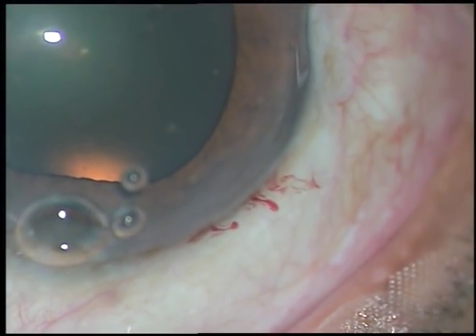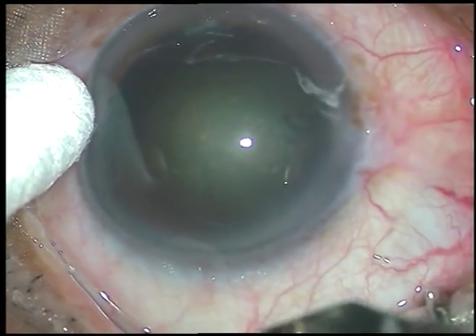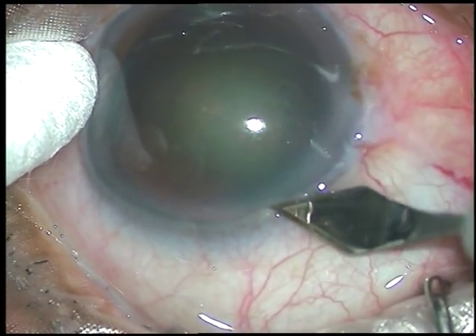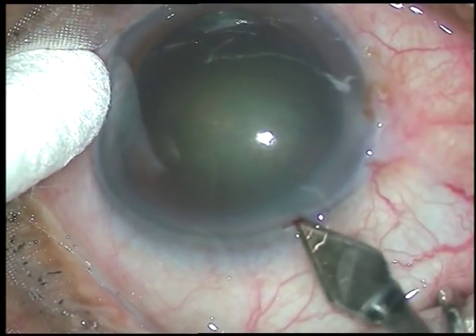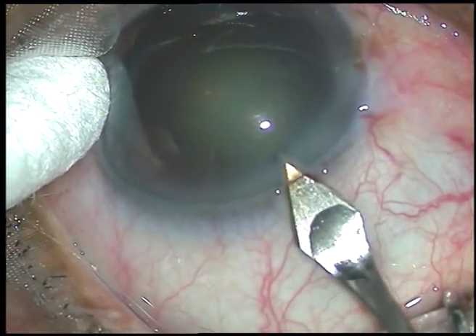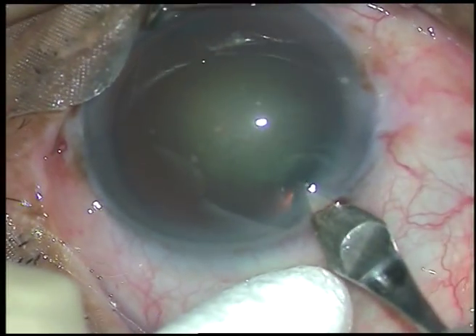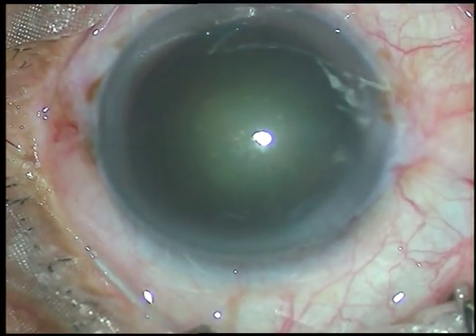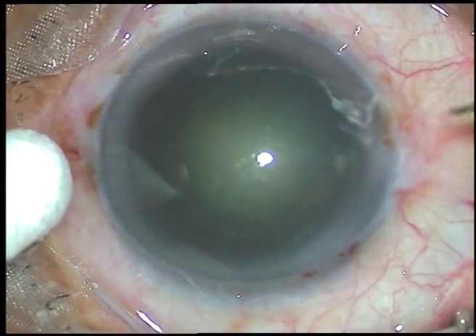Now this is another case under lower magnification. Small cut — engage it right there without lifting the keratome. Go for some distance and then direct the teeth downward. That's it.